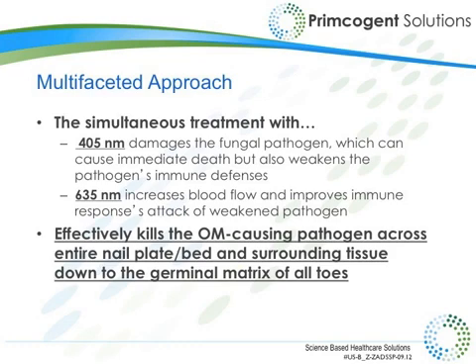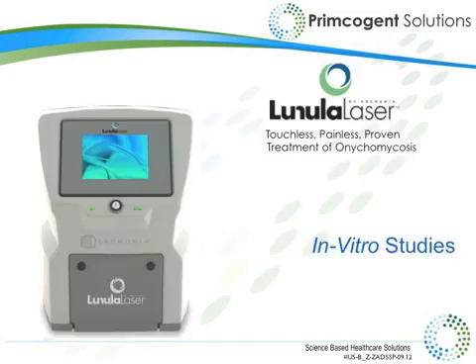And this treatment is going to cover the entire nail plate, nail bed, and even deep as the germinal matrix layer of all toes. To understand the clinical utility of the Lunula laser, we must begin analyzing the in vitro studies that have been performed.